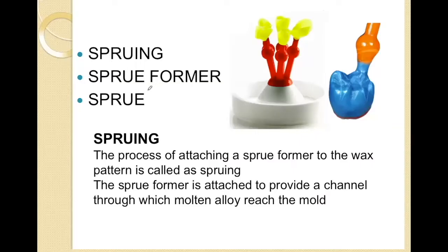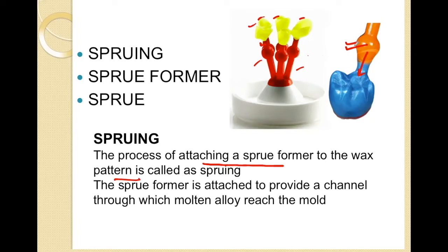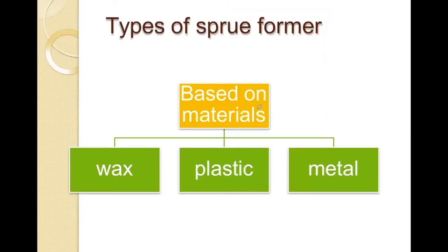Sprueing is the process of attachment of the sprue former to the wax pattern. This is our wax pattern and these are the sprue formers. The sprue former provides the channel through which the molten metal will flow into the prepared mold. The reservoir acts as a pool of molten metal to compensate for metal shrinkage which occurs during solidification. These sprue formers can be made up of wax, plastic, and metal.